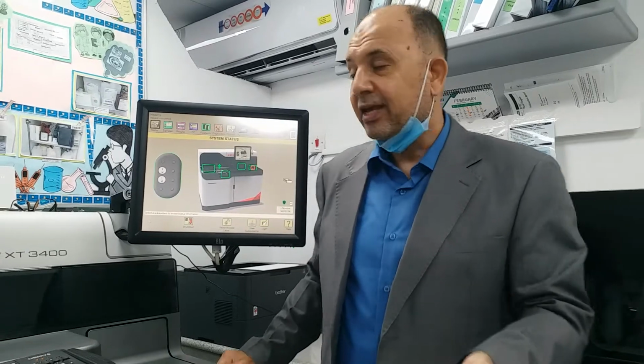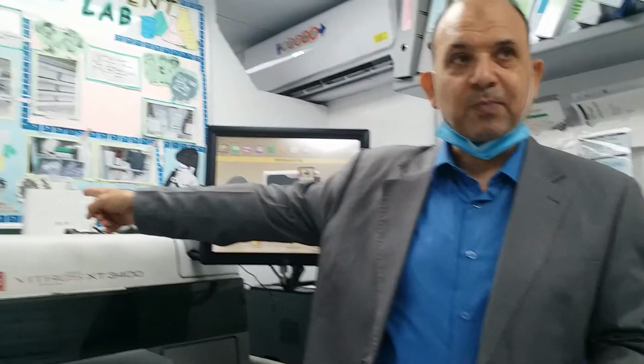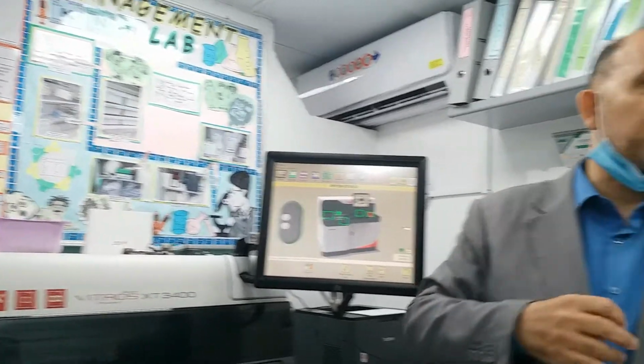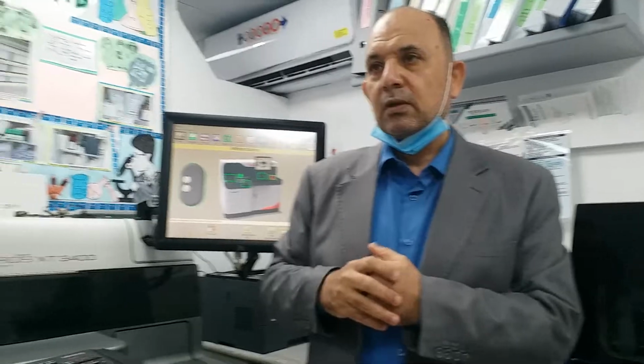The other thing, in case you are connected to the company, sometimes the people hacking the instrument move your connection from the company to another source. Hackers. Yes, hackers. This is just to check out your result. You check for something strange in your instrument, or data being put in which keeps transferring your data to some other place.